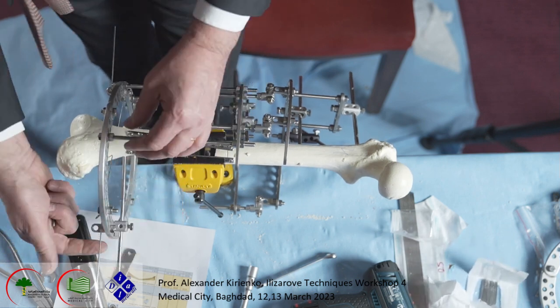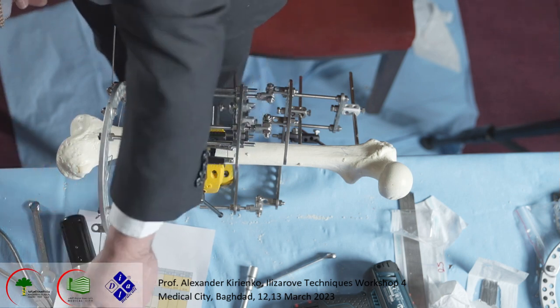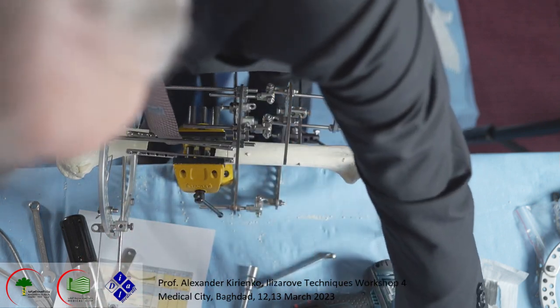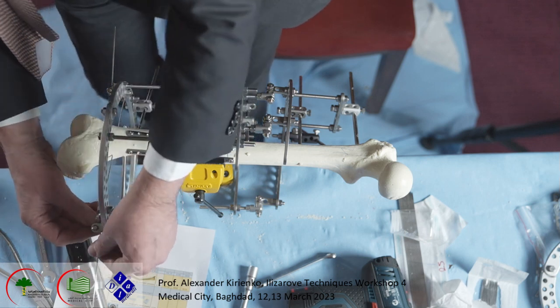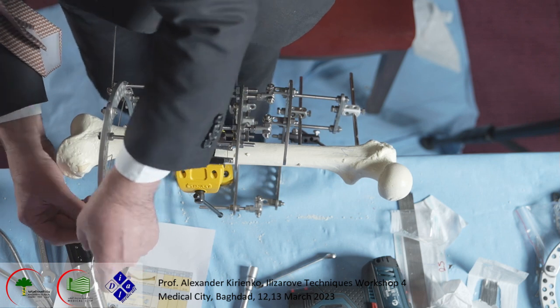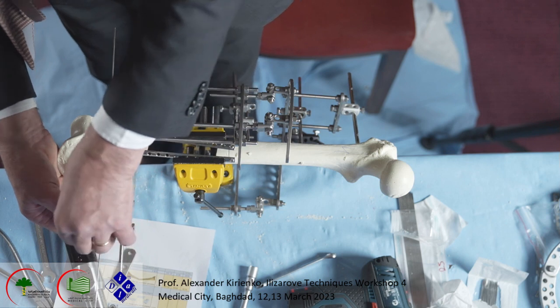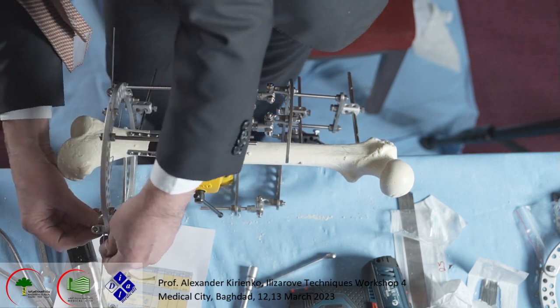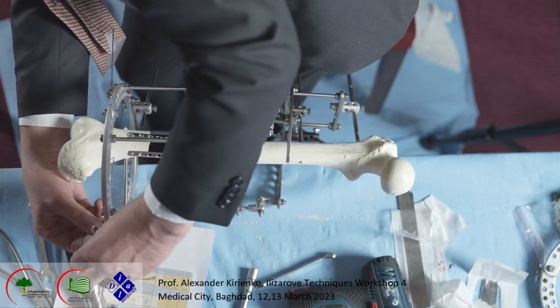Okay, like I said, you never bend the wire, because if you see this wire doesn't touch the post, you need to put the spacer, washer, and in this way when you tighten the bolt, it maintains the original position. Okay, go inside of this.